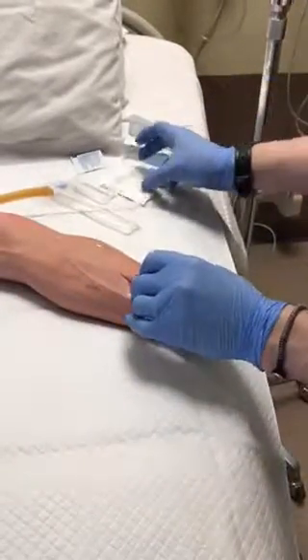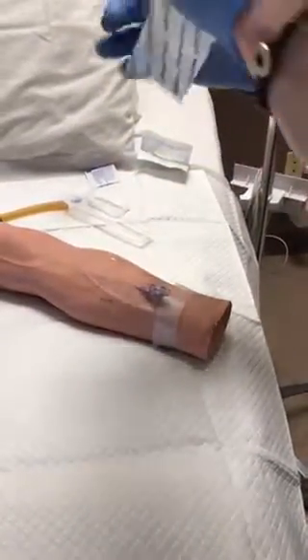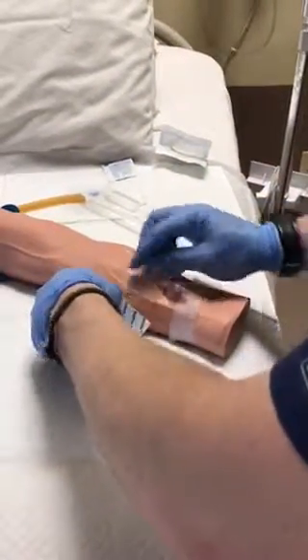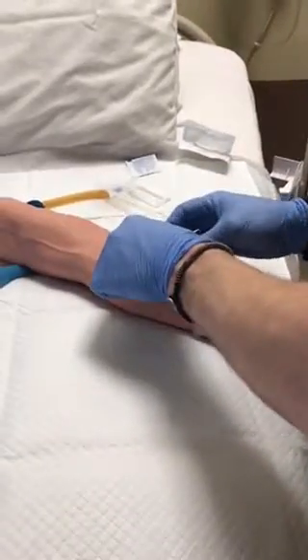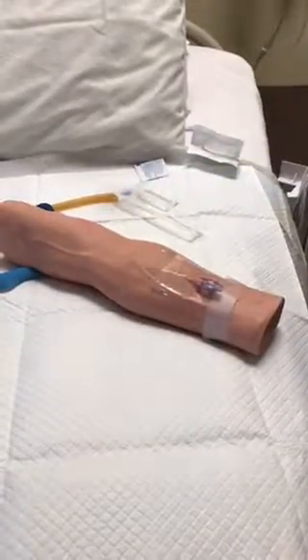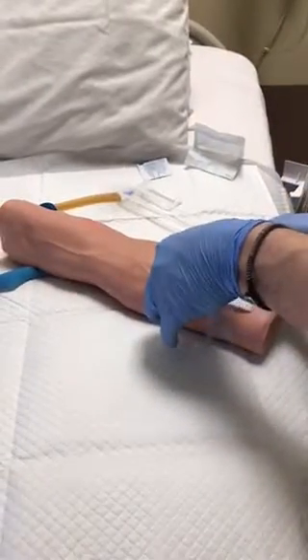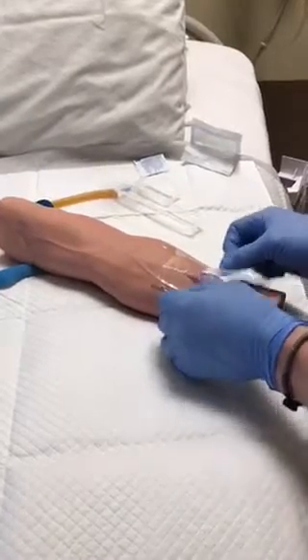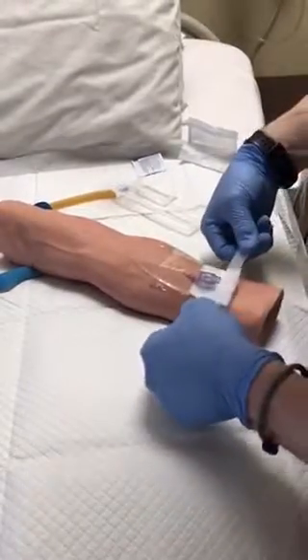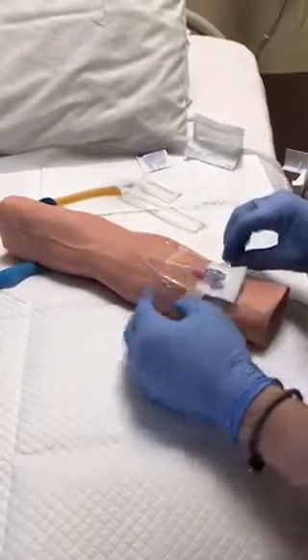Alright, you go ahead and hold still for me, Bob, okay? Okay. Cover the site with that. Take that down. Alright, since I got the site, I'm going to go ahead and pad underneath it for patient comfort. Use that, stick it down.